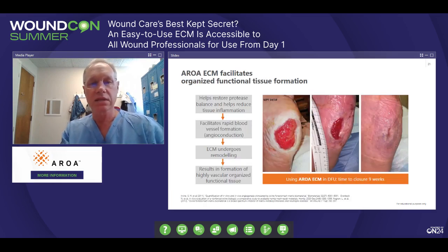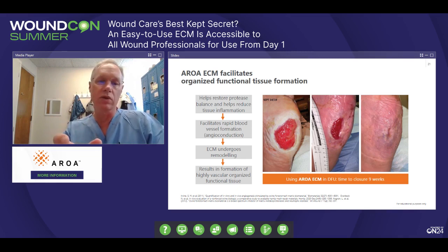So this is a typical DFU case. Again, as I look at this, one of the big things we always want to control is the edema component. So if you look at the peri-wound margins, make sure you're using adequate compression, dealing with, say, wound pH, and dealing with the micronutrients, that again would help facilitate. So you can see good wound bed prep on the side with good granulation tissue, no bone exposure, no tendon exposure, no undermining, a little bit of peri-wound maceration, of course, that we want to address.